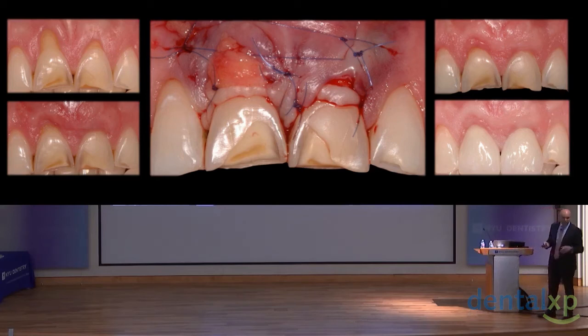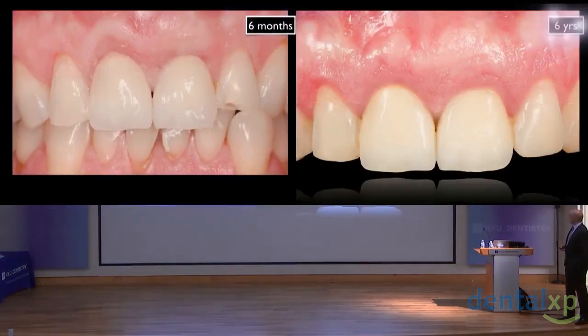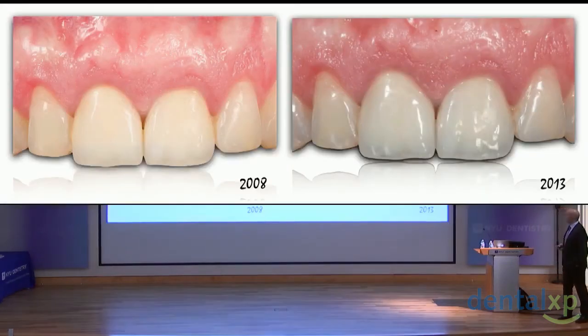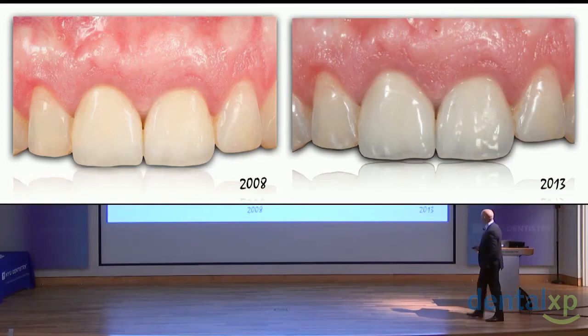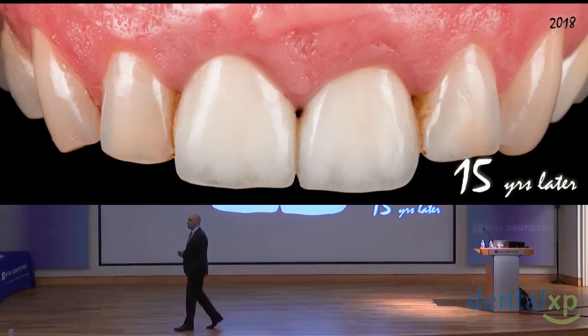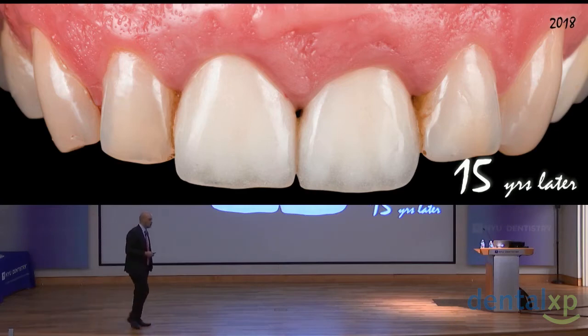so you say to me, oh, Ramon, but look at the result, not very good. But the good thing about getting older is you learn how to wait, you know. So let's look at the case after some years. We didn't know anything about this. 6 years later. 6 years later is not much time. Let's look at the patient in 2008, 2013. Okay, let's look at the patient 15 years later. In 2018, this year, 6 months ago, more or less. Quite a result. It wasn't covered at all.